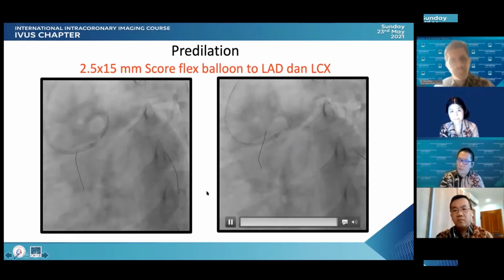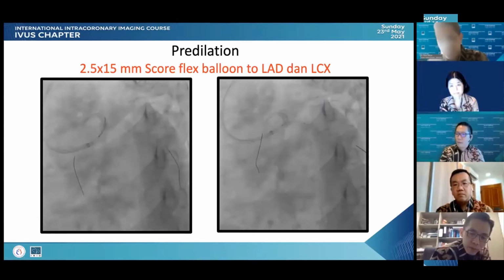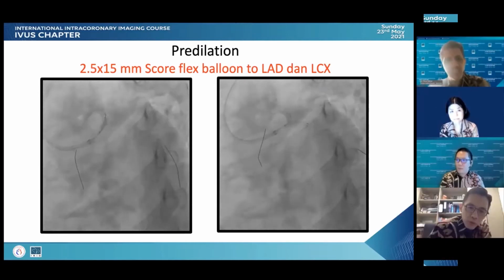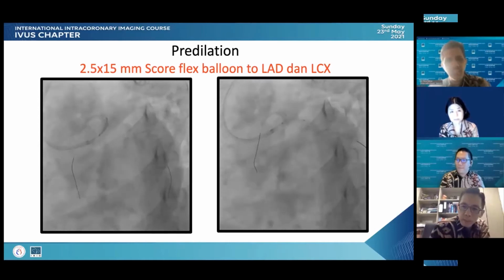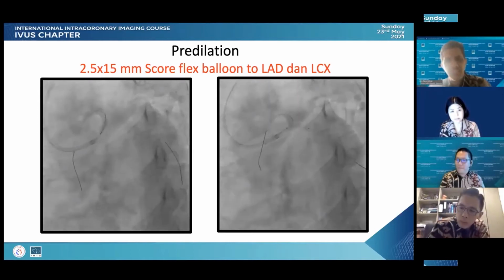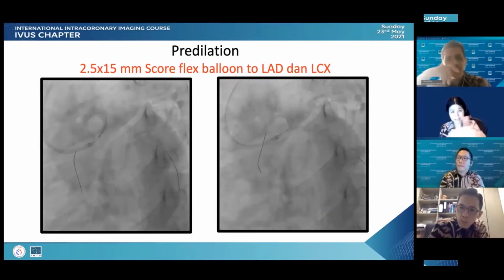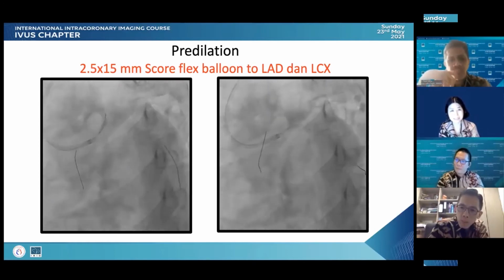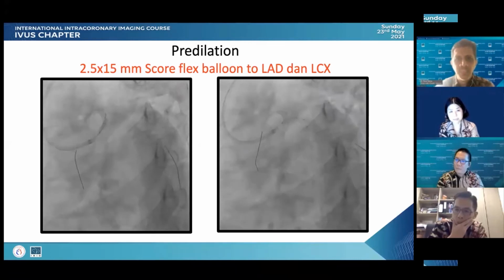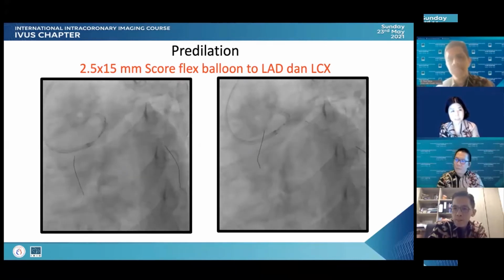Can I ask a question maybe to Prof. Akiko and the panel? In the presence of calcified nodules, would you be more conservative when it comes to balloon sizing and stent sizing? I think that's a good point, because we see the calcified nodule, but remember there is eccentric calcium, and the other side is actually relatively normal. That's typically what we see. That is a concern, but typically we don't see an issue because the normal side is stretching well.